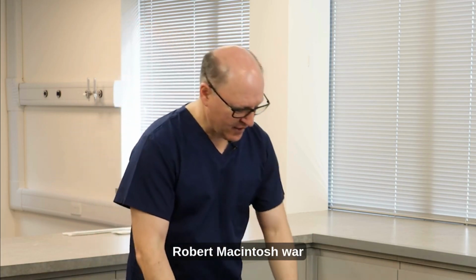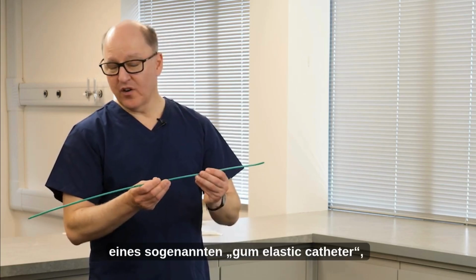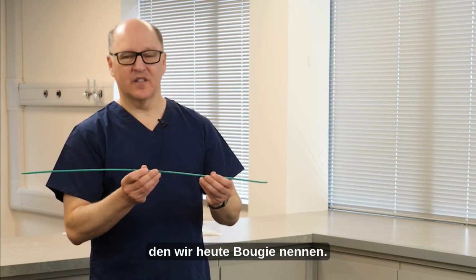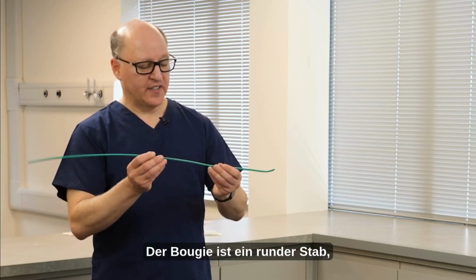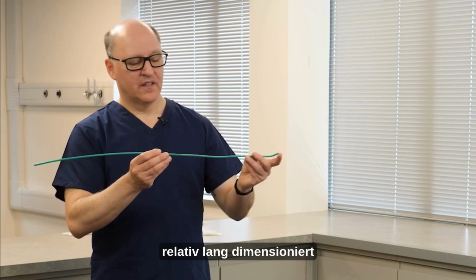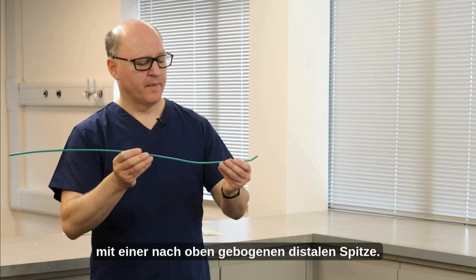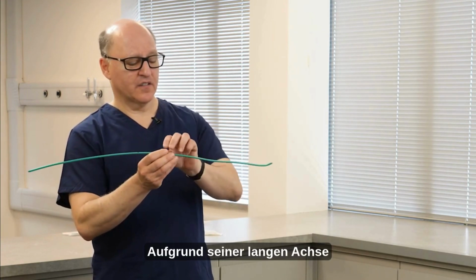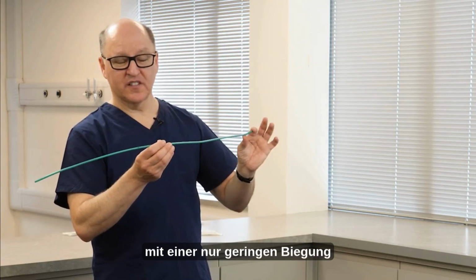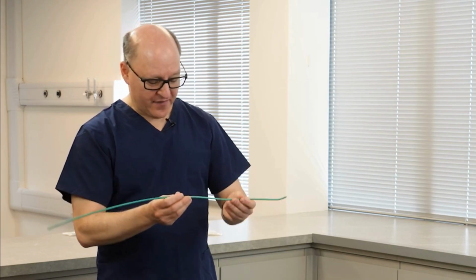And Robert Macintosh in 1949 was an early promoter of using what he called a gum elastic catheter, what we now call the Bougie. The Bougie is a round rod, relatively long, 65, 70 centimeters long. It has an upturned distal tip, and because of its long axis with a small distal deflection, its side-to-side dimension is very narrow.